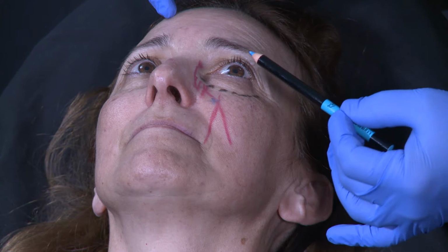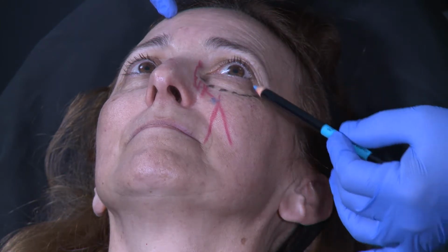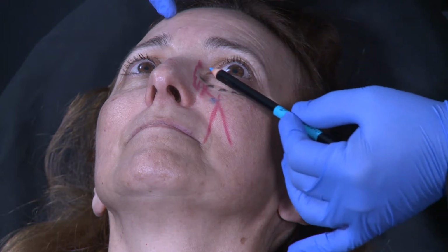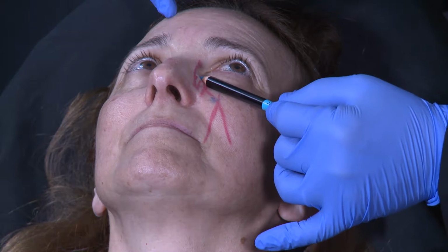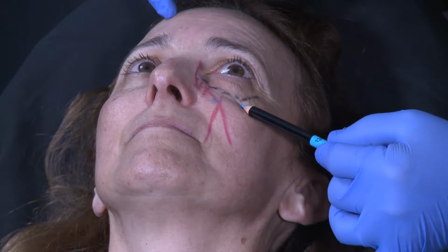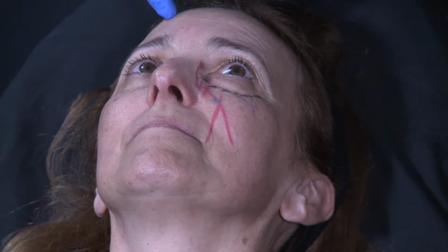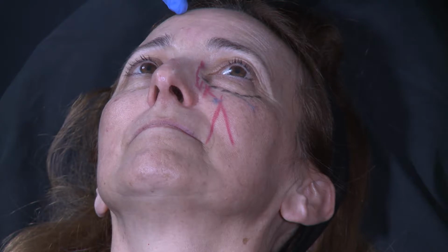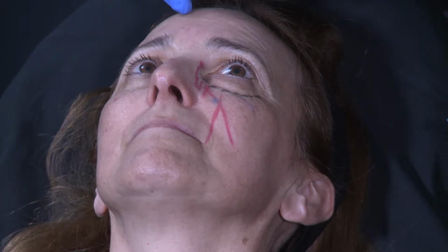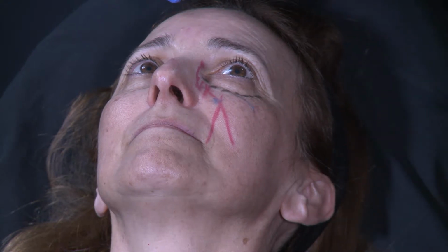Which cannula will I use? This is also a technical point. You need a cannula that will allow you to reach the inner part here of my tear trough. So it means the length of my cannula here will need to be enough to reach this point. And the length here, I calculate before I do my injection, it's around 42, 44 millimeters. So I will use a 50 millimeters length cannula.